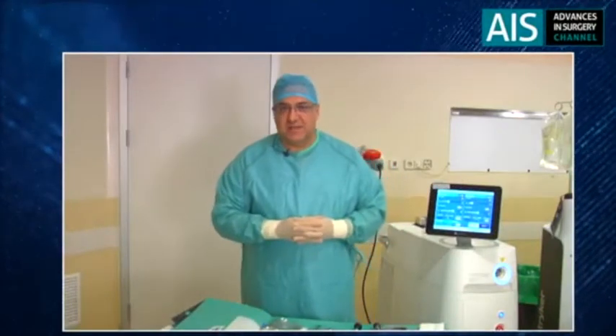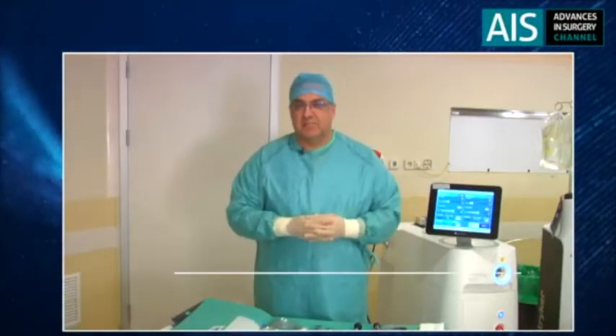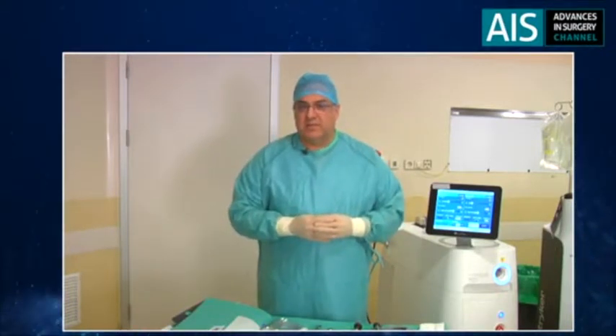Hello, my name is Fernando Gomes Sancha. I am a urologist and I am highly specialized in laser prostatectomy. We're going to present a case today of en bloc MoLEP — this means MOSES HoLEP with early apical liberation. I think this is a very exciting new development in the field of holmium laser enucleation of the prostate, and we will have plenty of time to discuss the advantages of this approach.